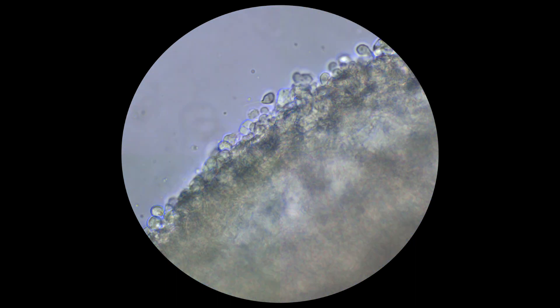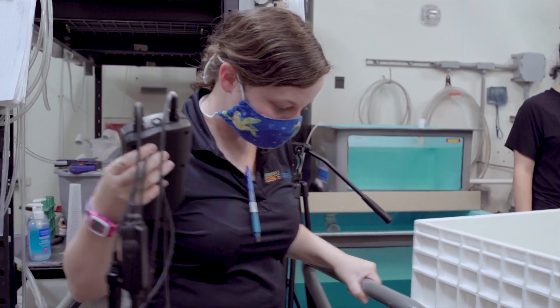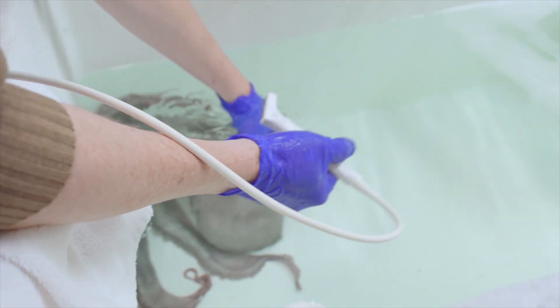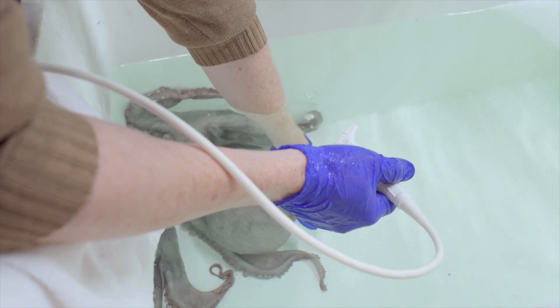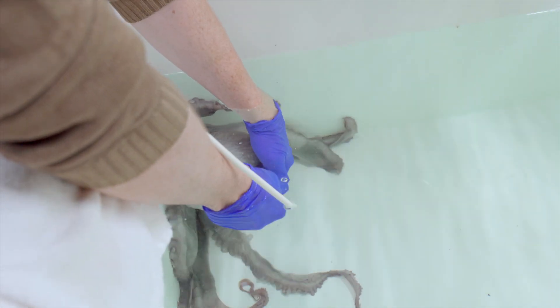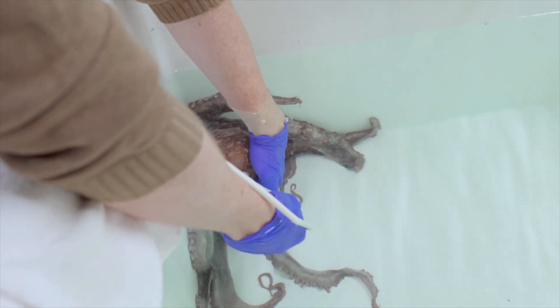We had to move the container of water — it was a 55-gallon container, which is a lot of water and takes a lot of people to move. We needed to move it closer so that Dr. Sam didn't have to stretch his instruments too far. After we got the water moved, we went ahead and did a full body ultrasound, mostly to assess all the organ health and get a good look at all of her insides.